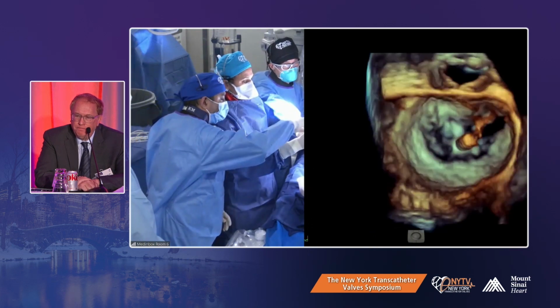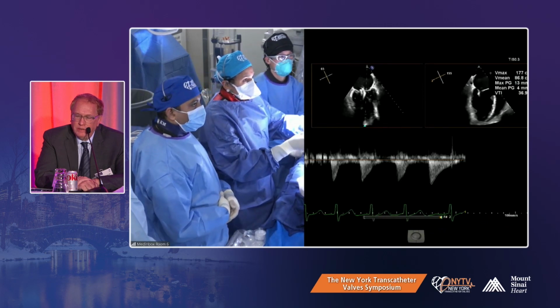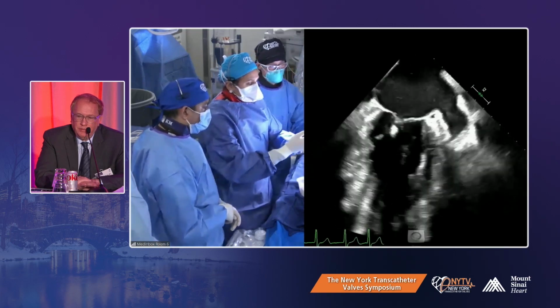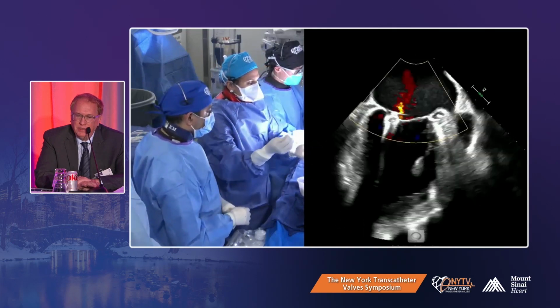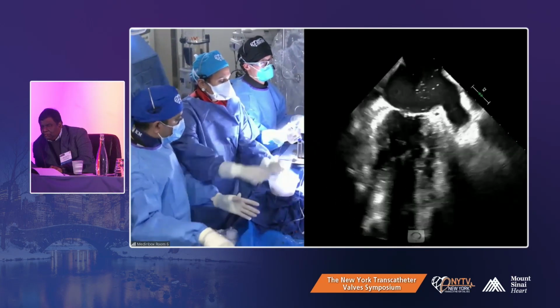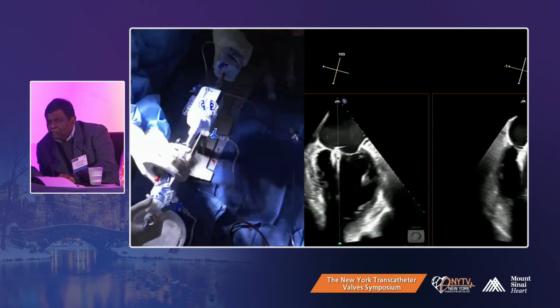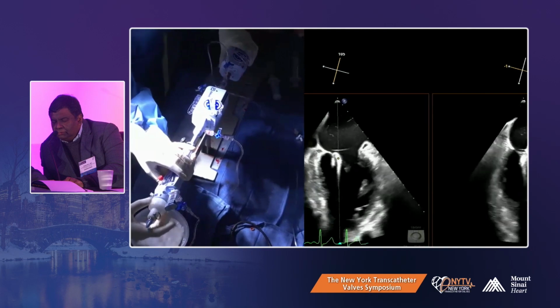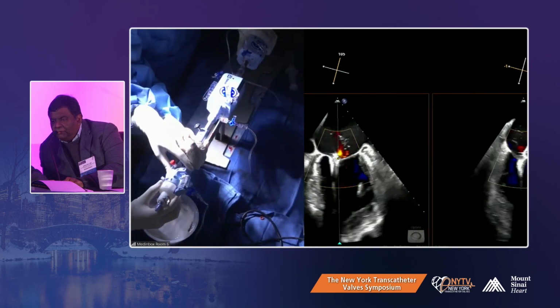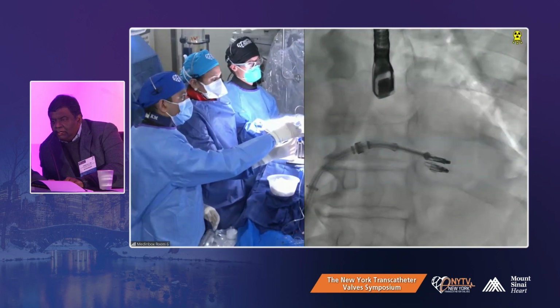Dr. Kinney, the pulmonary veins have normalized, so we are ready to release. If everybody agrees, you are going to release the second clip also. Yes. Okay. Can I just see a few color images for the audience, some echo images, because it looks very nice, and a 3D en face view. That's only trace MR from one side, a normal pulmonary vein flow pattern, and clips which are nice and parallel.